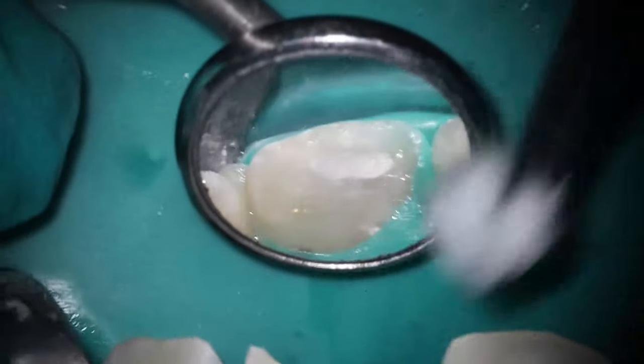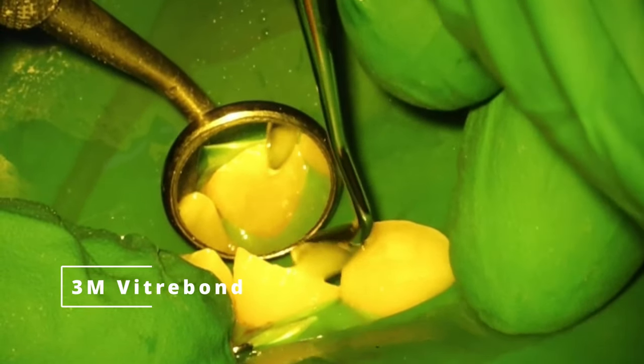So first thing you're gonna do is take a dry cotton pellet and just remove any excess. You wanna expose that. Do not etch, do not etch, do not etch. Etch is the one thing that will kill pulps like nobody's business. So I'm putting Vitrebond on here. It is a 3M product. I have used it for years.